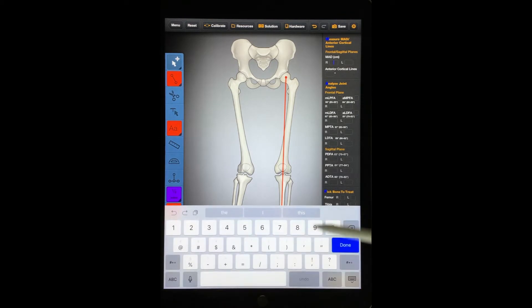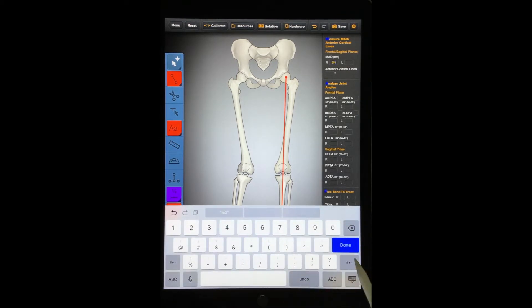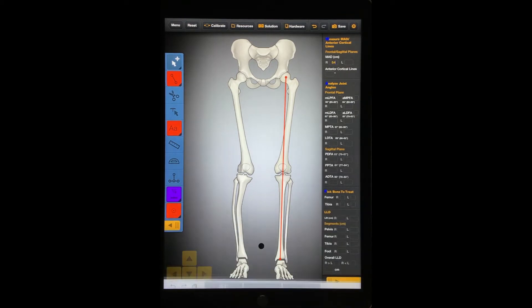Click on the orange tab at the bottom of the screen to reveal the measurement chart. You can record angle and length measurements in this chart. The values that you entered in the chart will remain even if you hide the chart. To hide the chart, press the orange tab again.